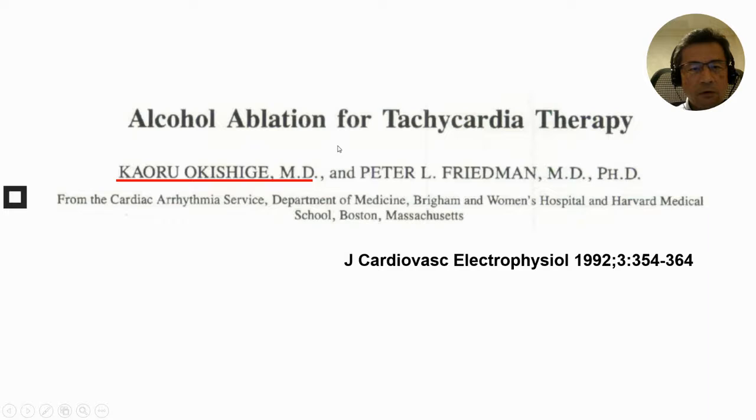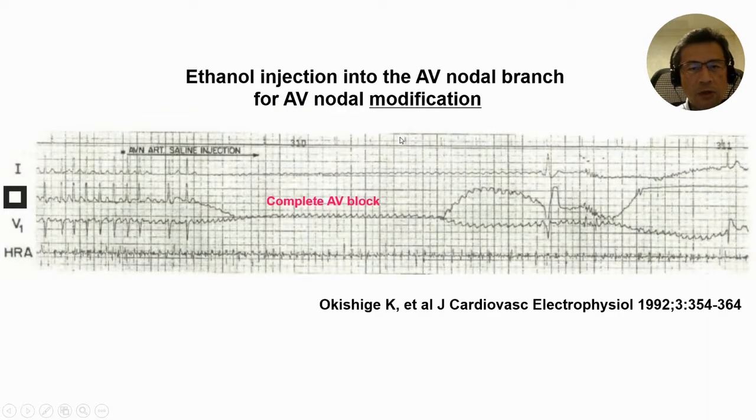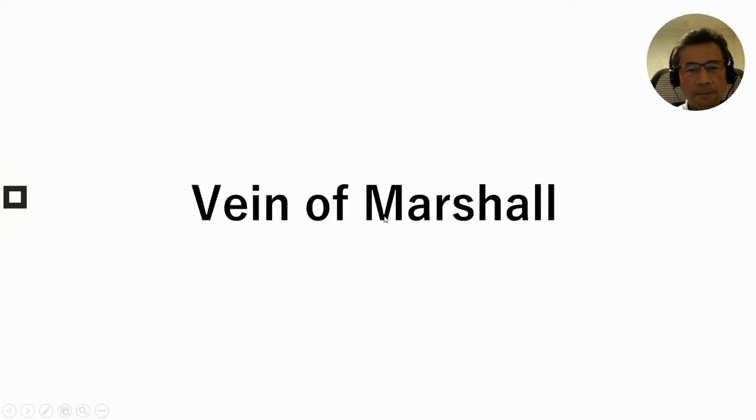We published a review article of alcohol ablation for tachycardia therapy. We injected ethanol into the AV nodal coronary arterial branch. We were able to create a complete AV block transiently, and the AV nodal conduction was modified afterwards.